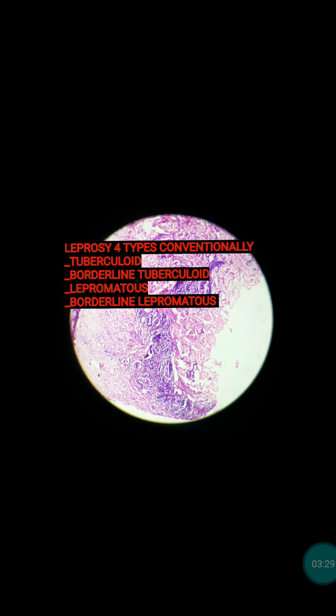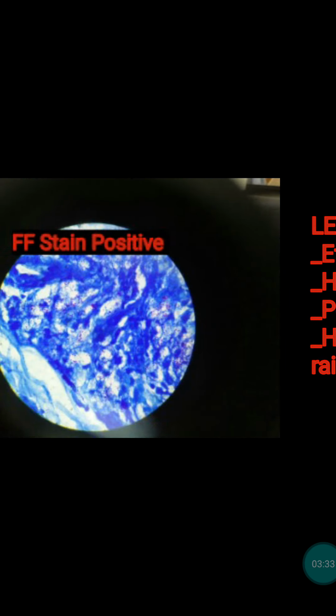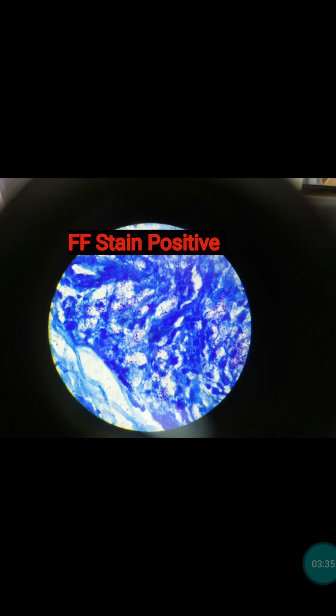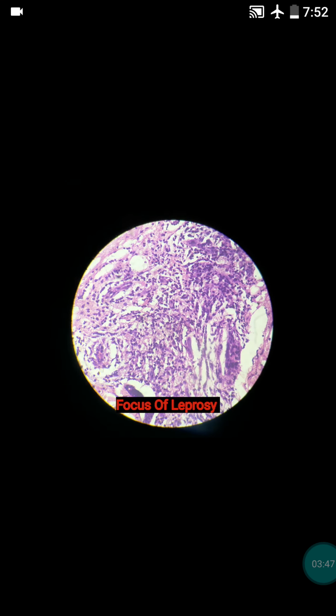You can confirm the diagnosis by Wade-Fite stain, which shows the acid fast bacilli in pinkish red color. This is the positive Wade-Fite stain.